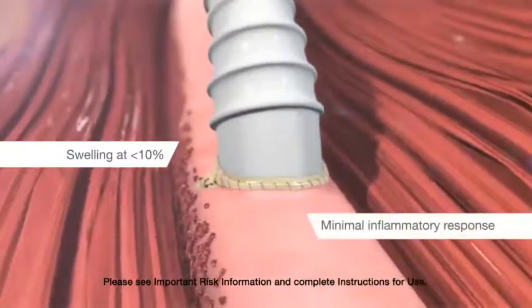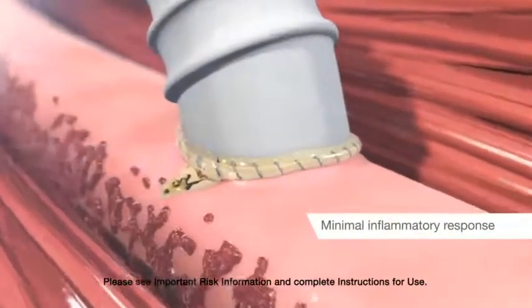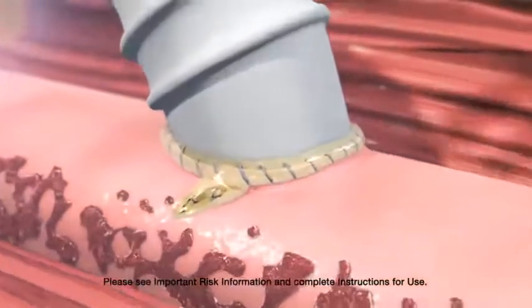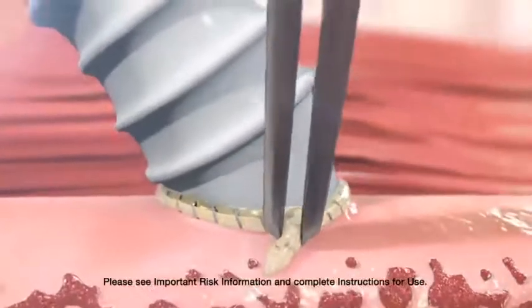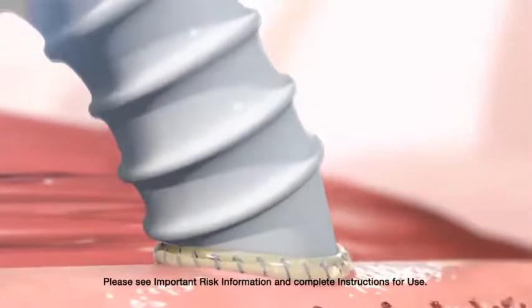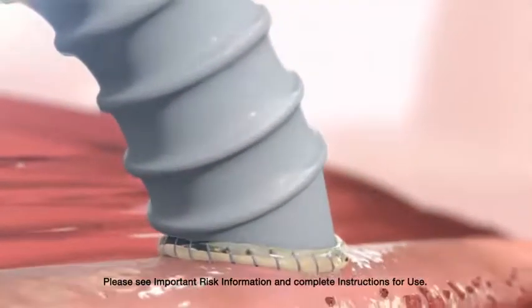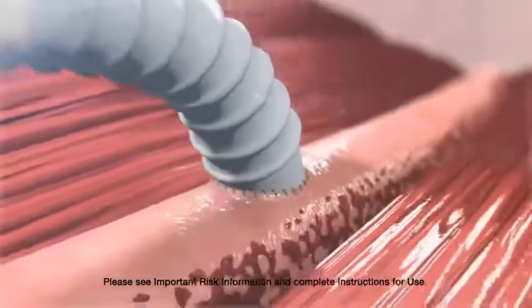The inflammatory response is similar to that observed with PTFE grafts and sutures alone. In the event that sealant is placed where it isn't needed, Previleak can be easily removed from instruments and from tissue, reducing the potential for damage. The sealant that is placed on suture lines is biocompatible and is naturally resorbed over time.